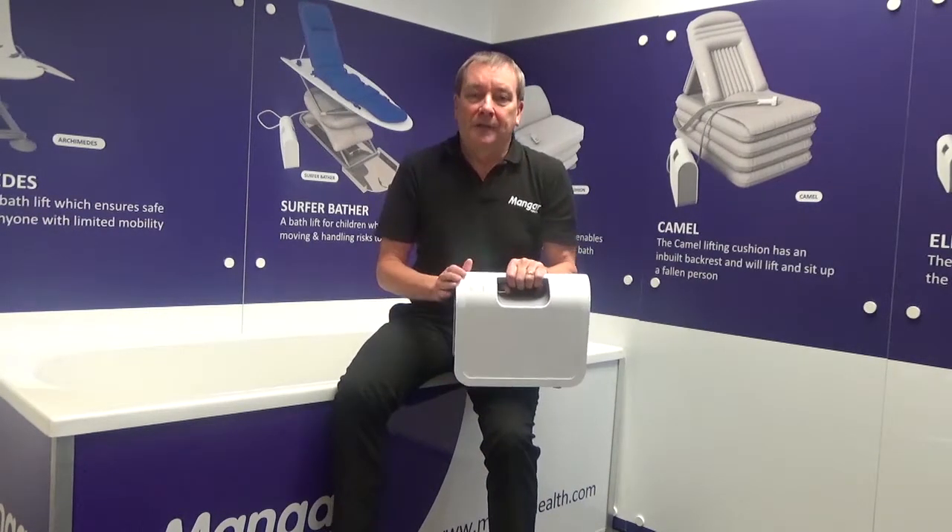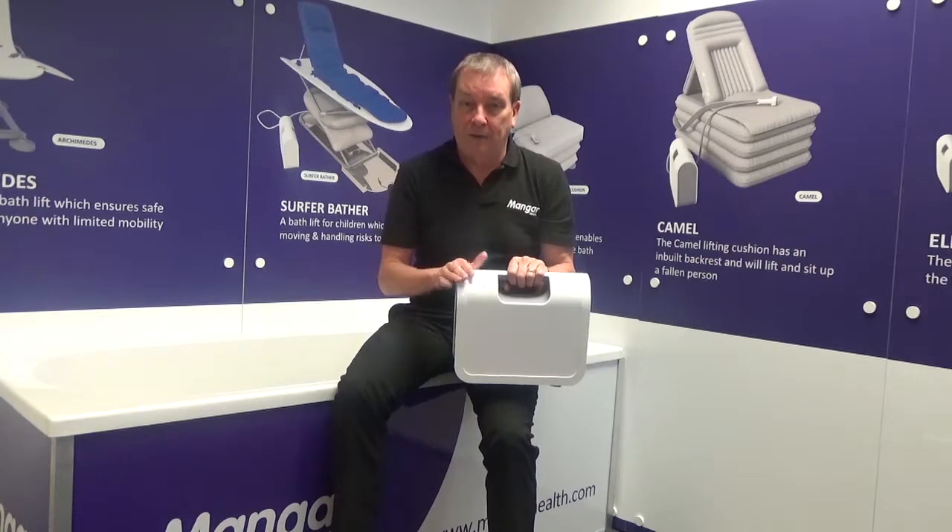Please note that you cannot overcharge the battery. So if the battery remains on charge permanently until the product is required for use, that will not harm the battery. Please ensure that every time the Elk, Camel and the compressor have been used, the Airflow goes back on charge when everything is complete. You cannot overcharge the battery.